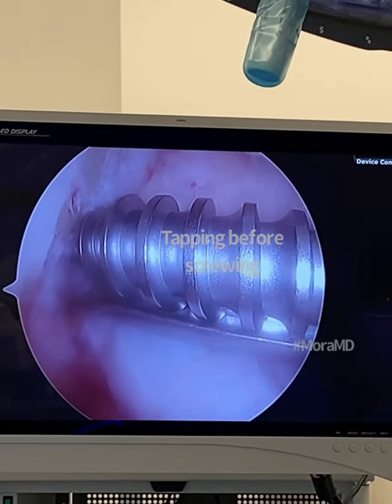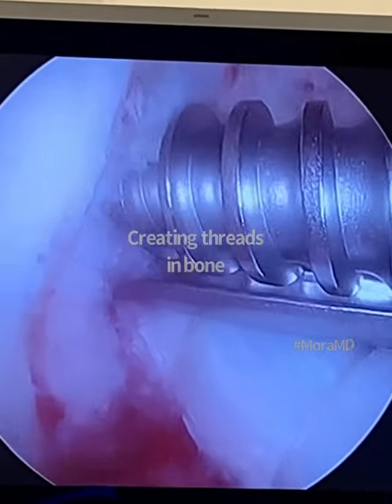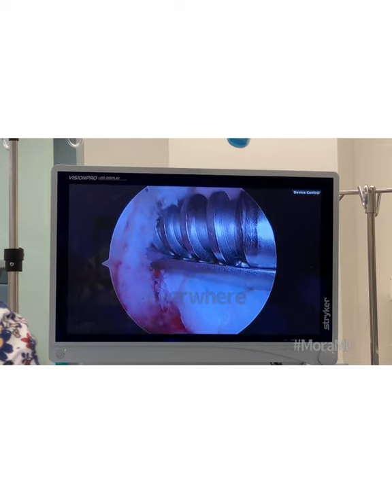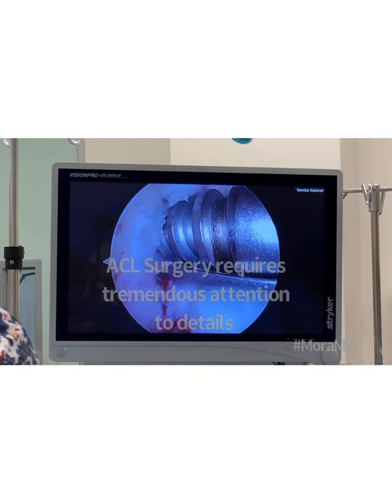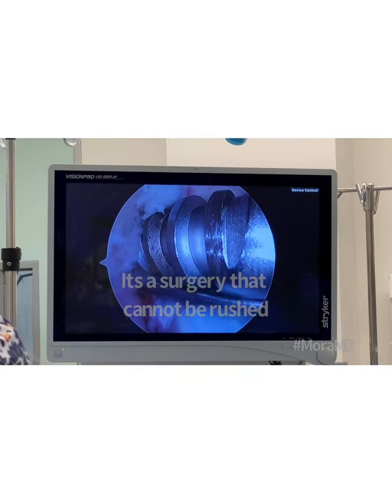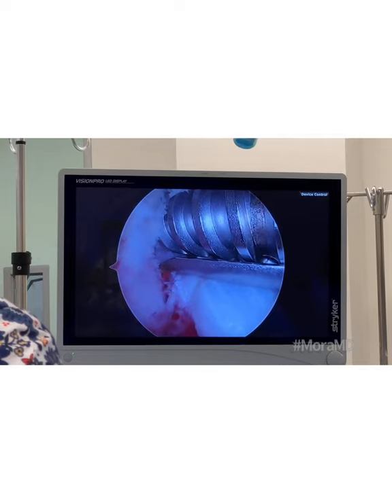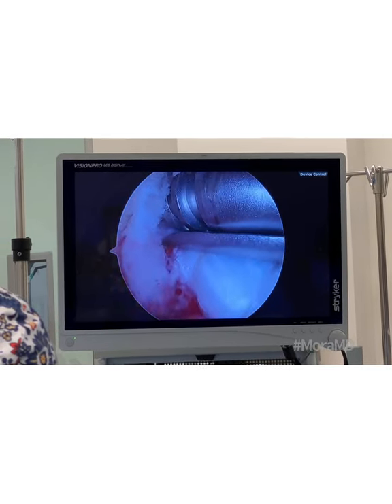The instrument in here is a tap — just like a woodworking tap. What I'm doing is tapping the space between the graft and the tunnel so that I can put in a threaded type of dowel. I'm doing this very slowly, because if I bully this tap in, instead of cutting threads on the bone, it might push my graft or even fracture the bone. Anyone who's done woodworking should understand. So I'm going back and forth very carefully — because creating a fracture here would cause a huge problem for this patient's surgery. We take it nice and slow; there's no rush. Once my tapping is done, I'll put in my screw.